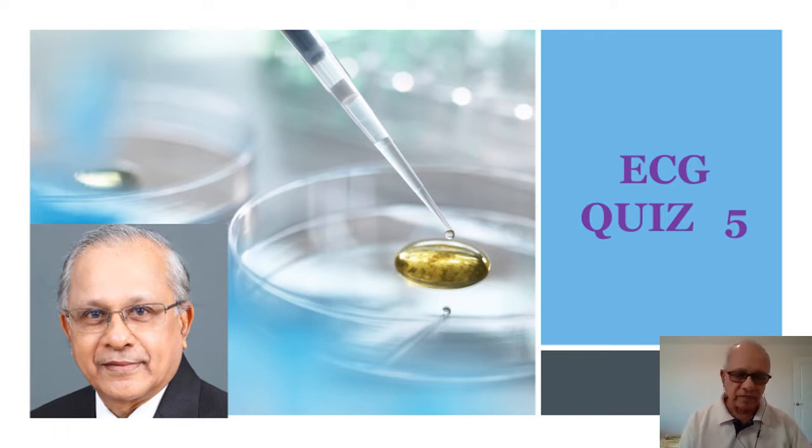If you have that in front of you while answering, the calculation of the QRS axis whenever I ask a question becomes much easier for you. So I would suggest that you have a printout of this, or you just draw a picture on a piece of paper and keep it in front of you when you are answering these questions.